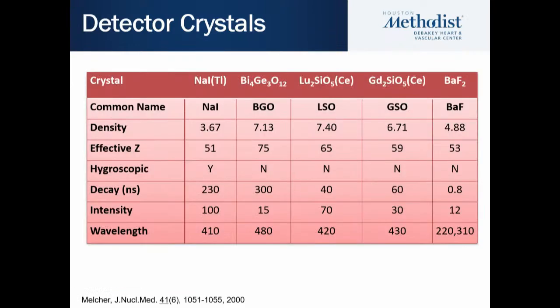And these are the different types of detectors that are available. Most of the ones that we are using in PET are the BGO or the lutetium based. The one that we have here is the LSO based, and they give you all that information.